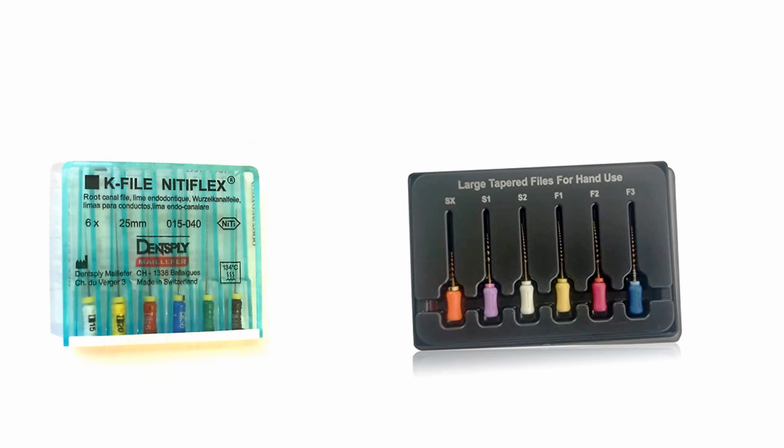Also we have our hand Protaper files, which are also made of niti, but these files are not that much flexible as compared to your Protaper rotary files. Okay, the Protaper hand files are somewhat stiffer, they are not that much flexible.